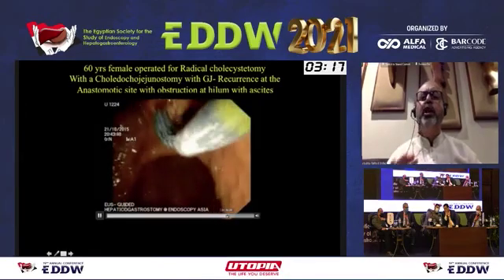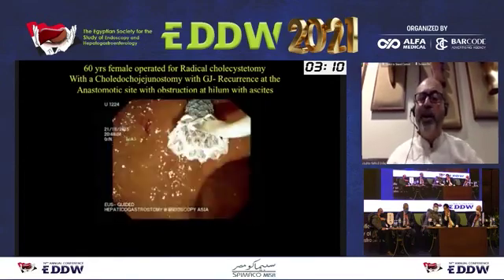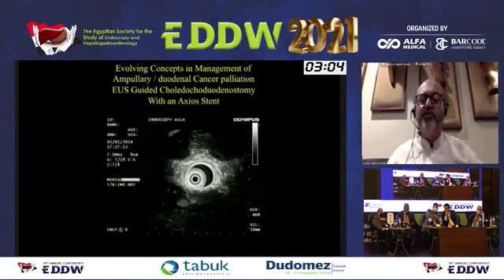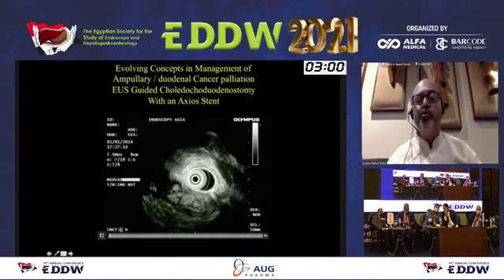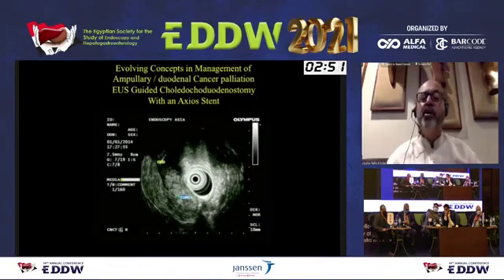Now, we don't routinely perform this procedure because in the majority of our patients ERCP is successful, almost 99.9% of cases, and these are cases of pure palliation where the patient has very advanced malignancy. Coming to the LAMS and the hot Axios, I want to share with you why we do EUS in every patient with a pancreatic or periampullary neoplasm or a biliary neoplasm.